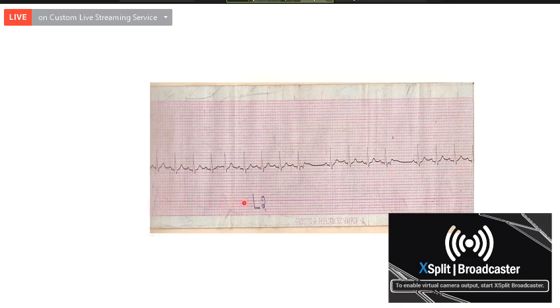So you can see that this is a blocked atrial ectopic and there is a gap. This blocked atrial ectopic traveled upwards, went into the sinus node, depolarized the sinus node, and has reset the sinus node. When the next sinus beat comes, it comes with a delay. So two blocked atrial ectopics are seen. That is the reason for this prolonged RR interval. Don't read it as an AV block. It is actually a blocked atrial ectopic.